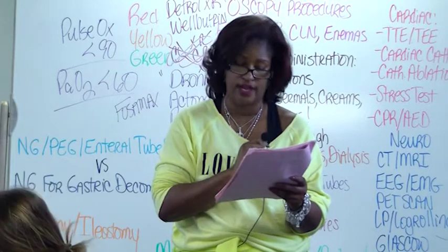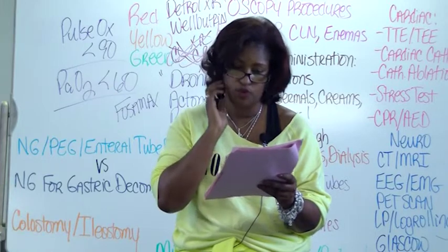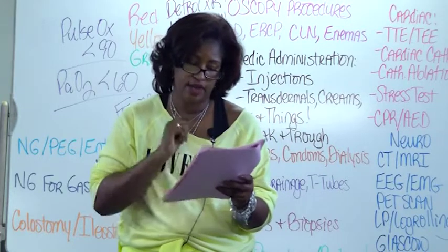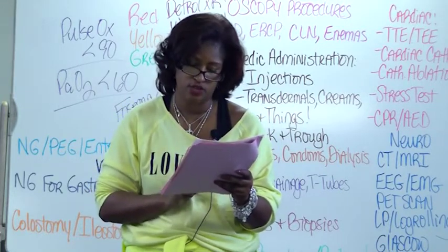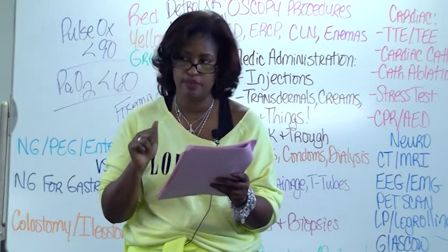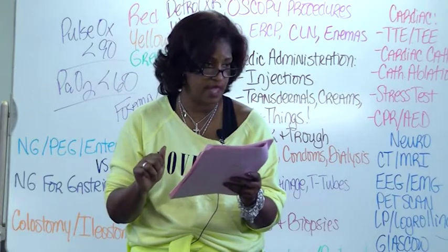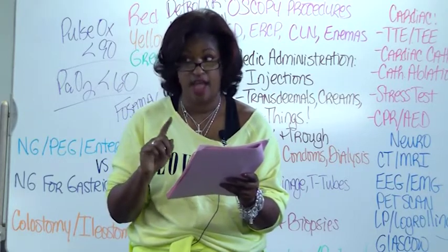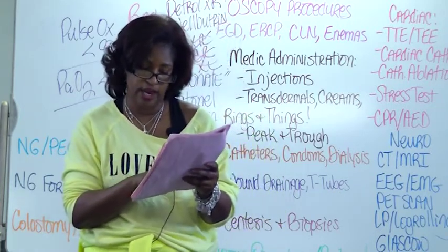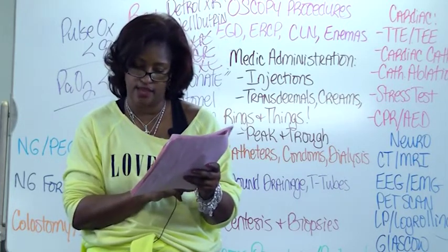Now, number 4. I cannot tell you how important this is to put stars all around. It's the most important one out of all the steps. Before you give medication through this nasogastric tube, you need to check placement. And don't you let me hear you out there blowing air, checking for a swish. What kind of thing is that? That is not ever supposed to be done. You are supposed to be checking it by aspirating gastric contents and doing a litmus test. What is a litmus test? A pH.